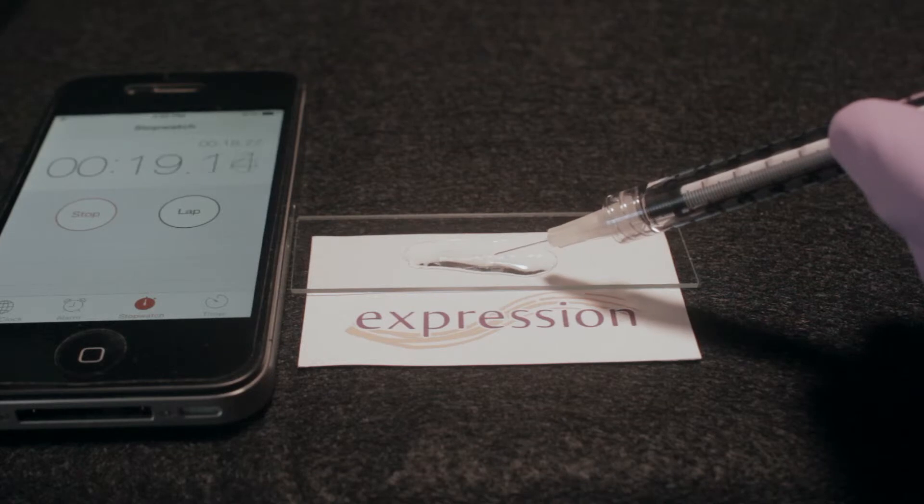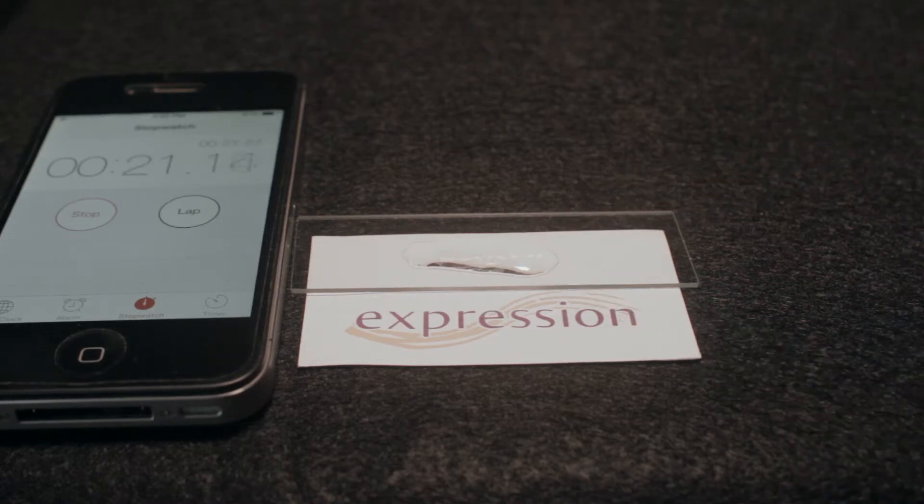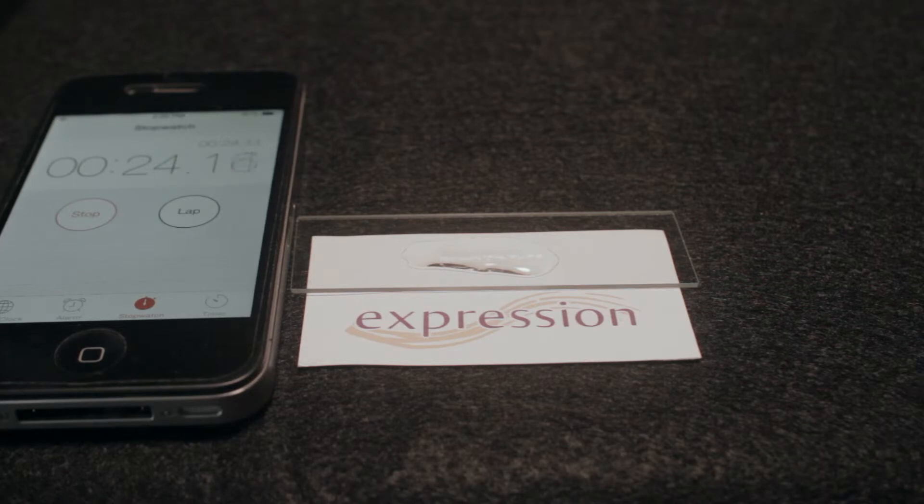We can see the breakdown take place right before our eyes. As the area is flooded from the initial blast of hyaluronidase, we can see the shape and form of the hyaluronic acid completely fall apart.